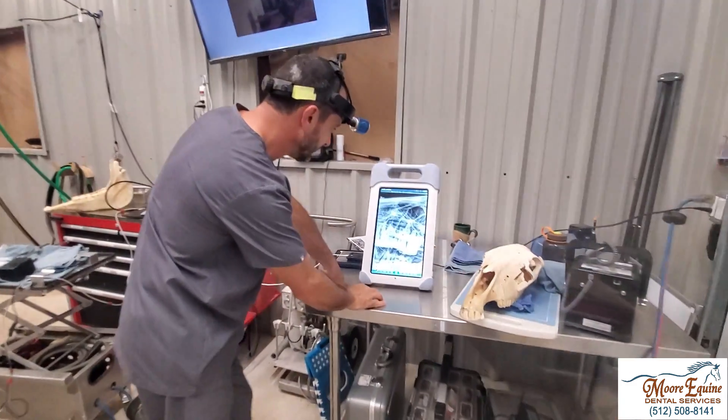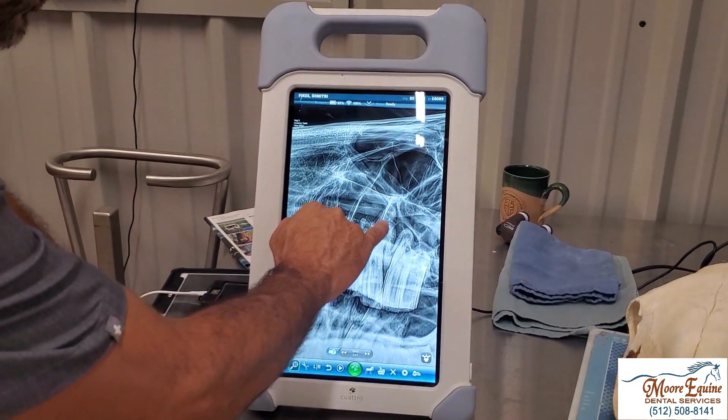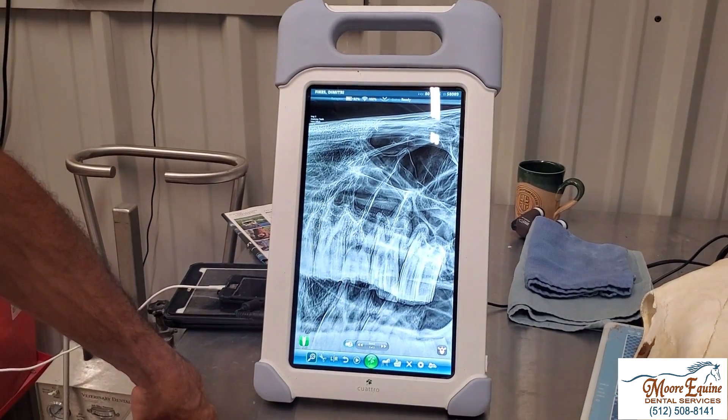We can look at the image we've got here. We can see quite a bit of sclerosis around the number 10 tooth and some enlargement of the periodontal space.